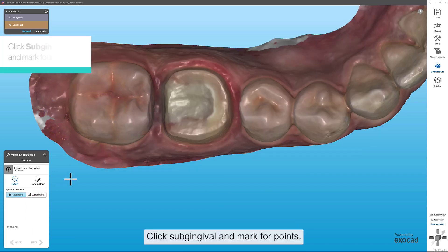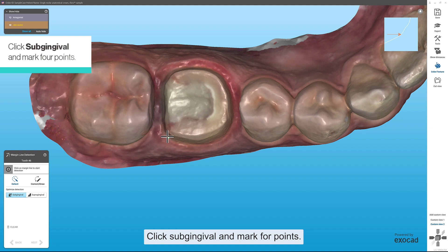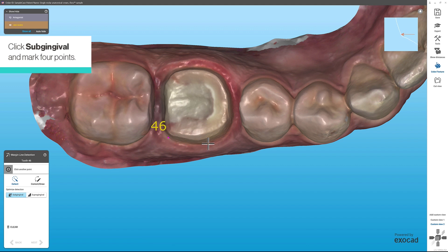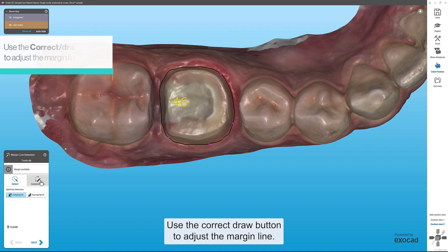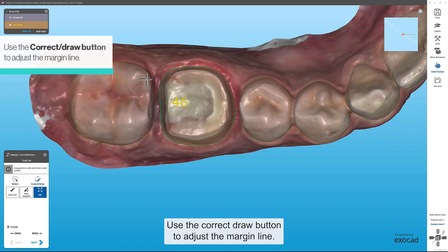Click Subgingival and mark four points. Use the Correct Draw button to adjust the margin line.